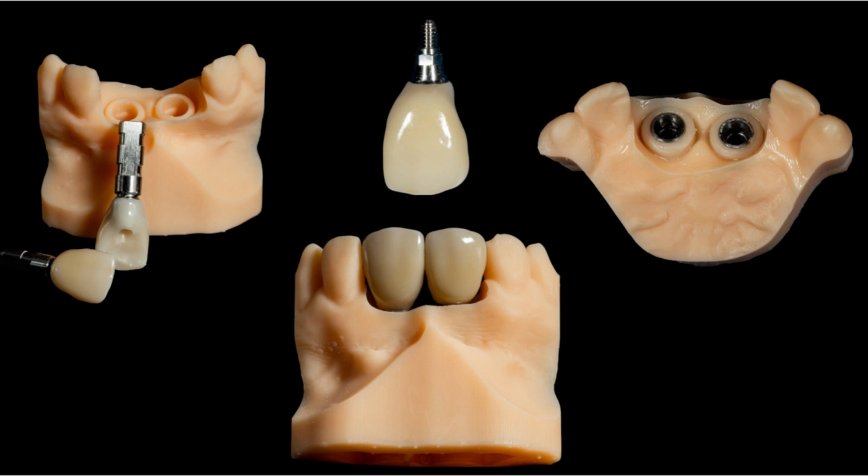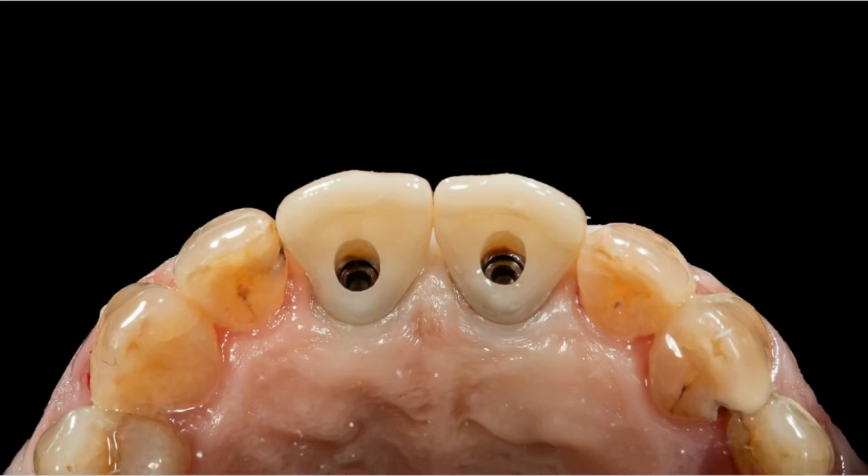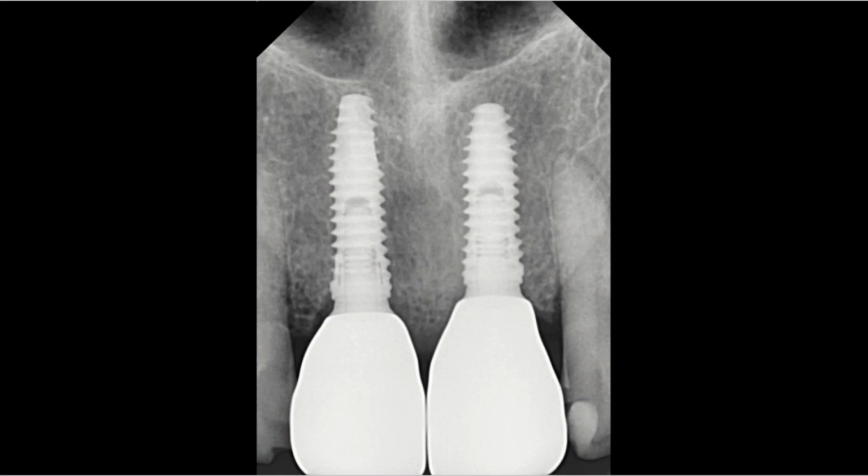Note the hex type is usually used in single restorations, of course, to avoid rotation of your final restoration. The final result is satisfying for your patient, just monolithic zirconia and extrinsic stains. No extra effort is needed, and the screw channels emerge perfectly from the cingulum, resulting in perfect function and aesthetics of the restoration. Here is the X-ray, showing the parallel view between the implants and their final position. Look how the restorations are fully seated and the margins adapted well to the substructure.